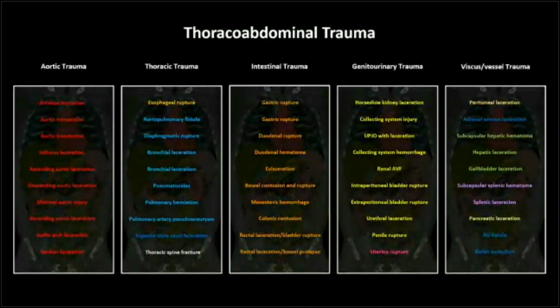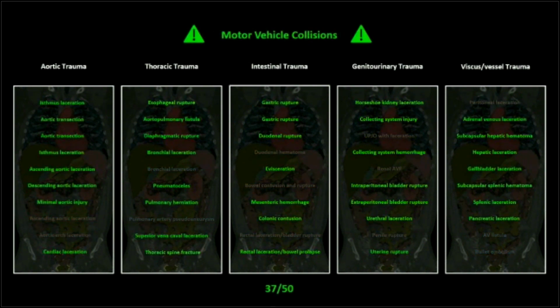All right, I have broken things down into 5 basic organ segments. I know there are a lot of them. I told you 3 years I've been working on this. Okay, but I also put some icons in so that you can see some basic facts about every case.